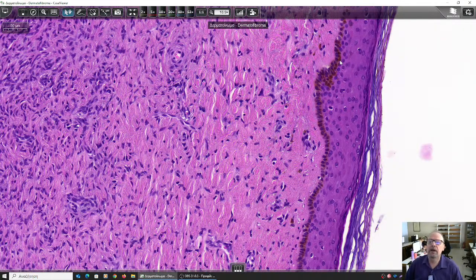Can you see something that is quite strange here? There is too much melanin in the basal cells. So this is a feature which has to do with the diagnosis, and it also makes us take into account that if we have a pigmented lesion of the skin, it is not necessarily coming from melanocytes.